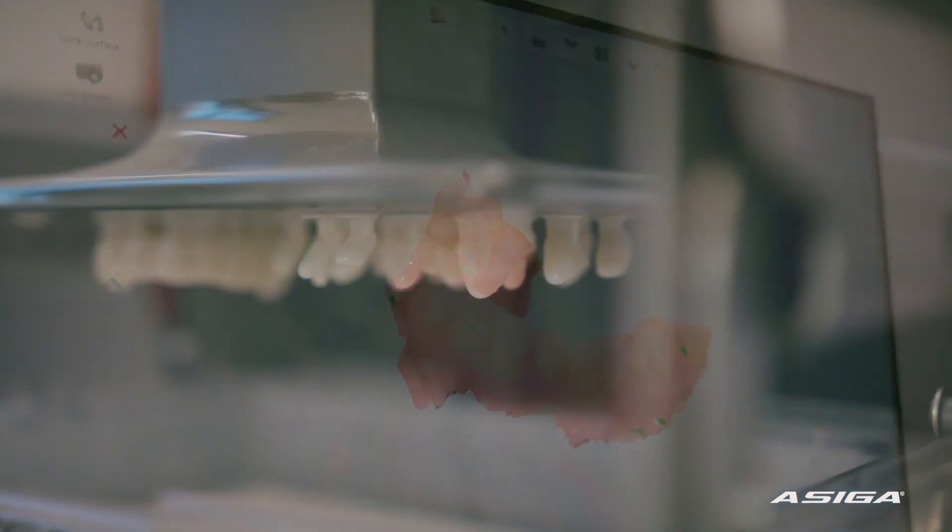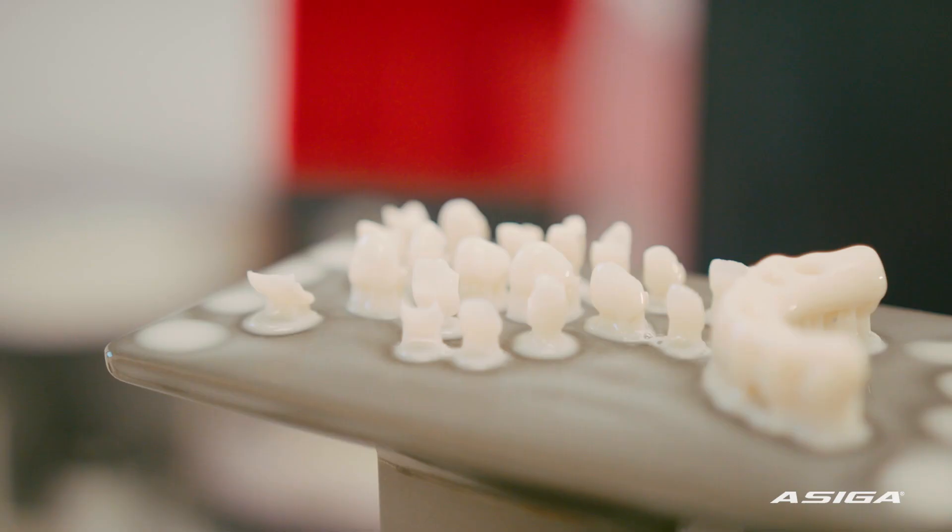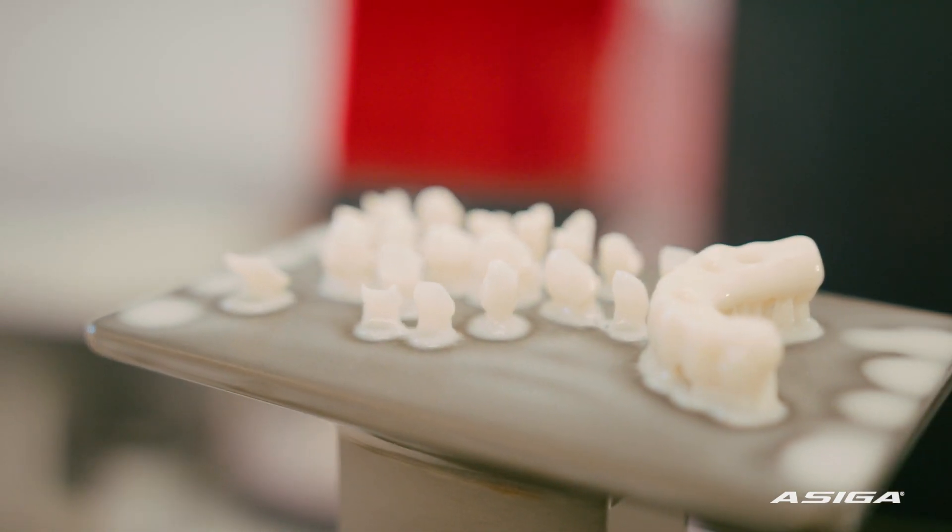We do a lot of surgical implant guides, we use it for a lot of study models to make retainers, we print our own occlusal splints, design and print our frameworks for the denture prior to castings — and it really accelerated our practice.